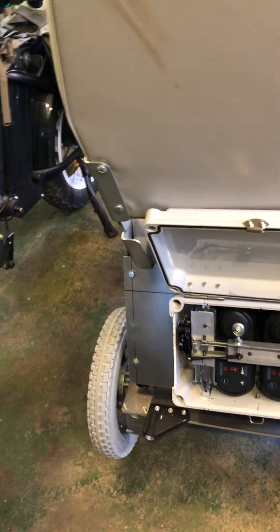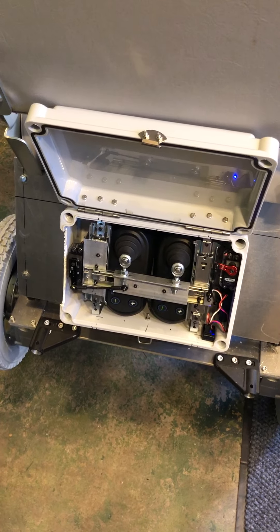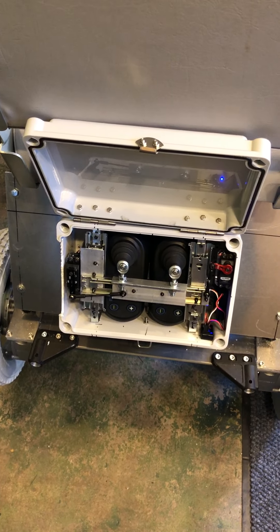And forward, up, right — all that fun stuff. So I like it and it works. I've ridden it and it's kind of clumsy.